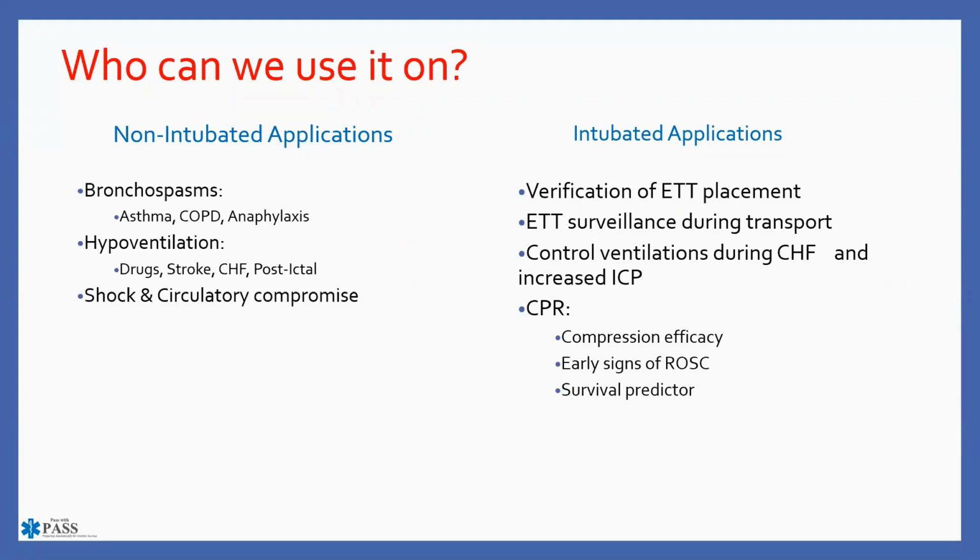As far as ROSC, back in the day, we used to do pulse checks. So every couple of minutes, you would do a pulse check. I'm just telling you that there's no reason to do that in today's world if you have capnography on. If the patient ends up regaining a pulse, you're going to notice that immediately, because their end-tidal CO2 hypothetically was at 14 under CPR, and all of a sudden it goes to 30. That is a pretty good indicator that there is a change in your patient, in which case now it would be appropriate to determine if the patient has a pulse. If that end-tidal CO2 is 14 and it maybe goes to 15, 16, down to 12, then you know that that patient has not gotten ROSC in that situation.